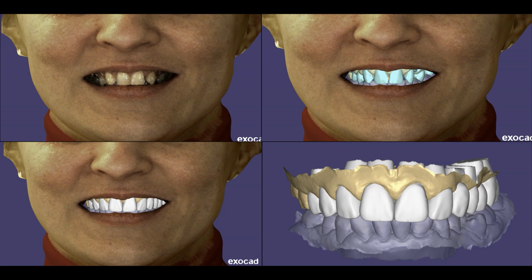Then we discussed the entire project with the patient in detail, incorporating her feedback and making necessary corrections. This allowed us to adjust the grinding process to the patient's individual requirements. This approach was key to achieving an optimal aesthetic outcome while preserving the health of the tooth structure.